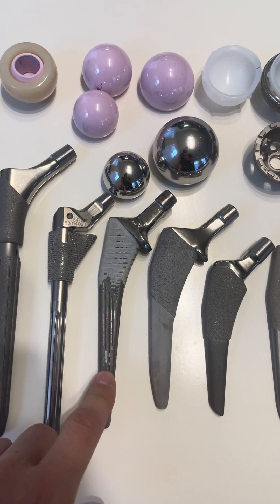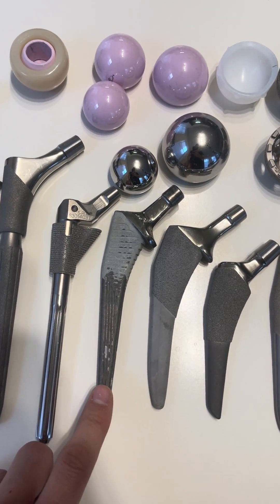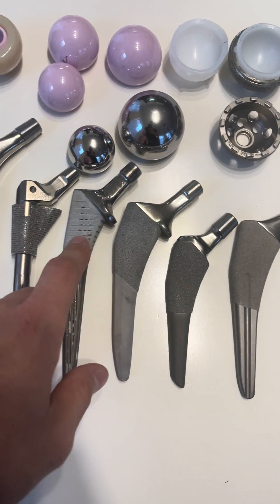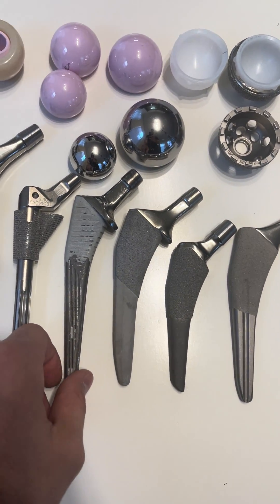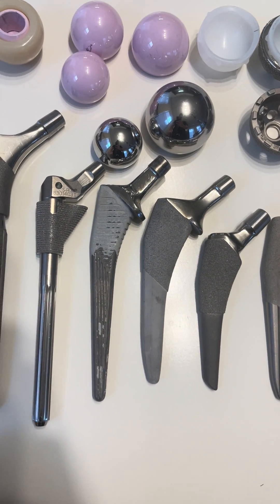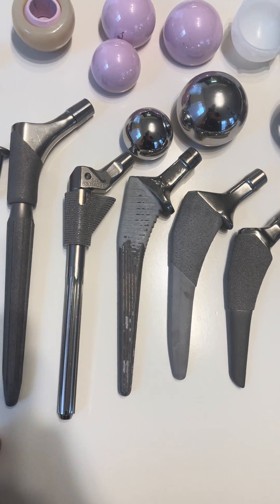This is a Cari-type stem. This stem has been around for a very long time. It's fully HA coated, meaning it ingrows all the way from top to bottom, so these can be very hard to get out if you have to remove them. It has a collar to prevent any subsidence in poor bone quality, and it's a very durable stem.